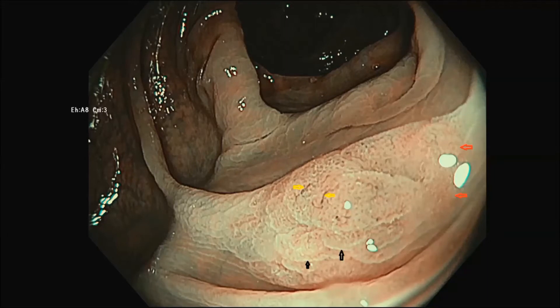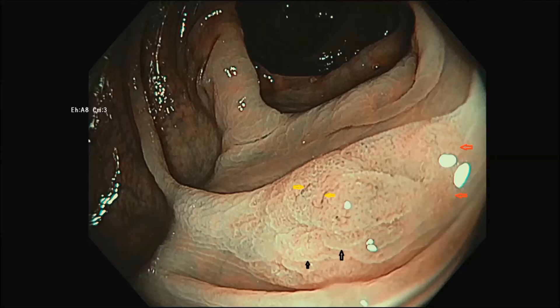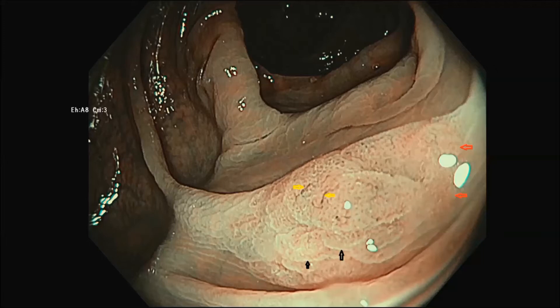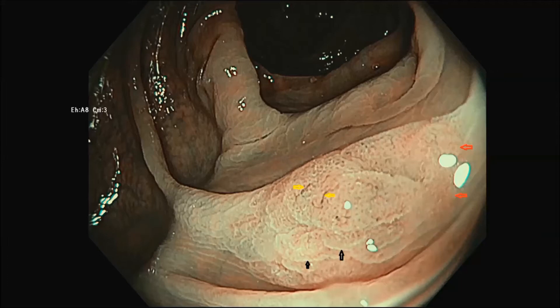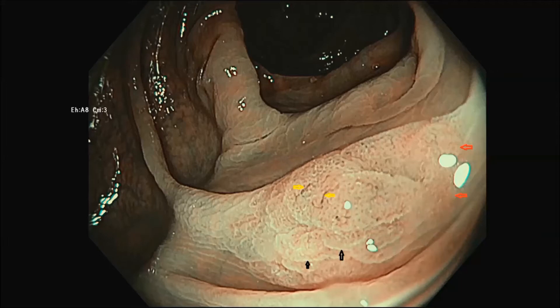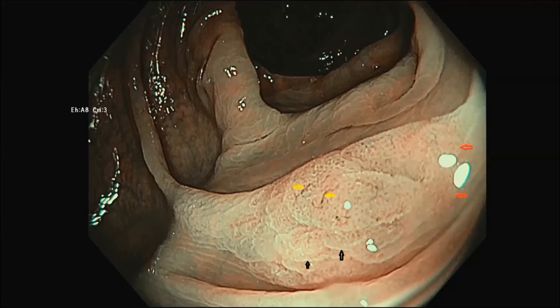Here is the initial lesion in the sessile serrated polyp to cancer sequence — the sessile serrated polyp without cytological dysplasia. This lesion has nice type 1 features, and demonstrates several features typical of sessile serrated polyps as opposed to hyperplastic polyps. It has large open black pits, indiscrete edges as shown by the red arrows, parallel white lines with a cloud-like appearance designated by the black arrows, and very few blood vessels — the yellow arrows point to the only vessels visible on the surface. There are no features to suggest dysplasia.